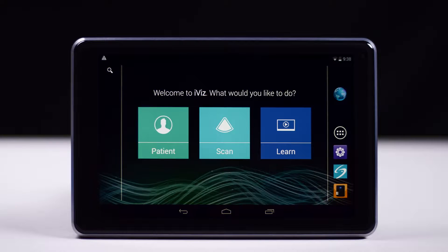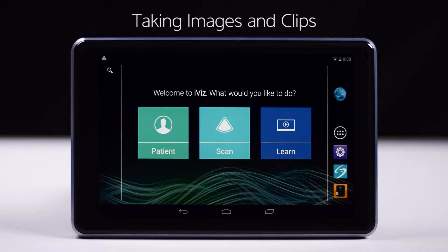Welcome to the help video on taking images and clips. In this video we will walk you through how to take an image and a clip and then export it to your USB drive using your iViz ultrasound system.